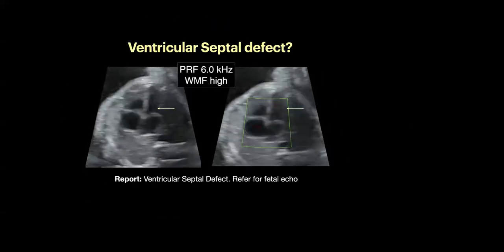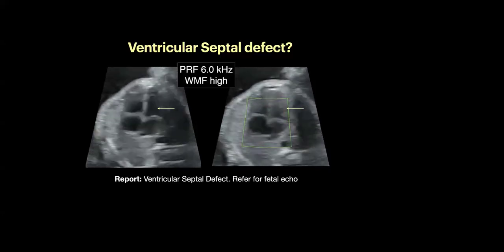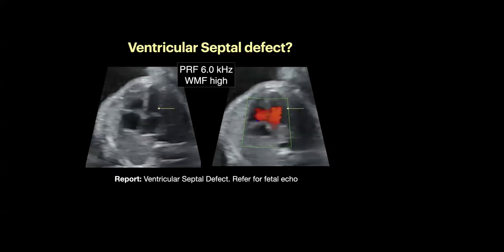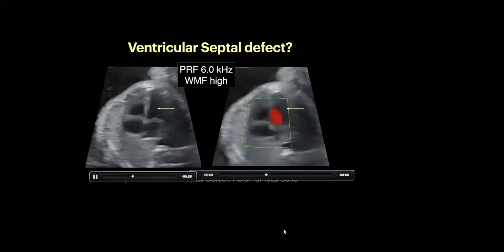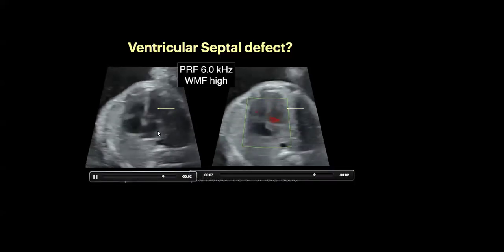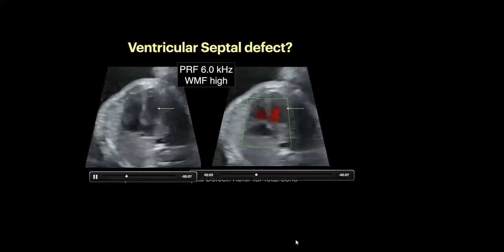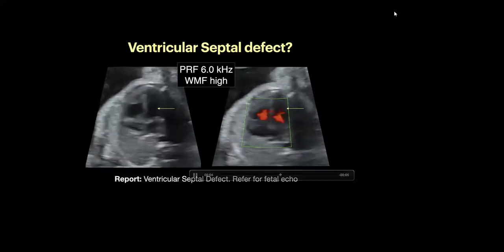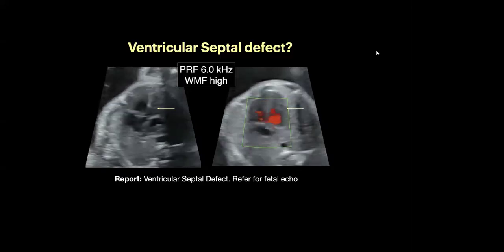So how about looking at this view here? Here's just an example of a case. A patient came in just for routine imaging. Here you could see the four-chamber view as well. So a nice, proper apical four-chamber view. You could see those AV valve offsets beautifully. And then the sonographer turned on color Doppler, and we see a lot of bleeding on here. And this is where you start to get your suspicion, is there a possible VSD?